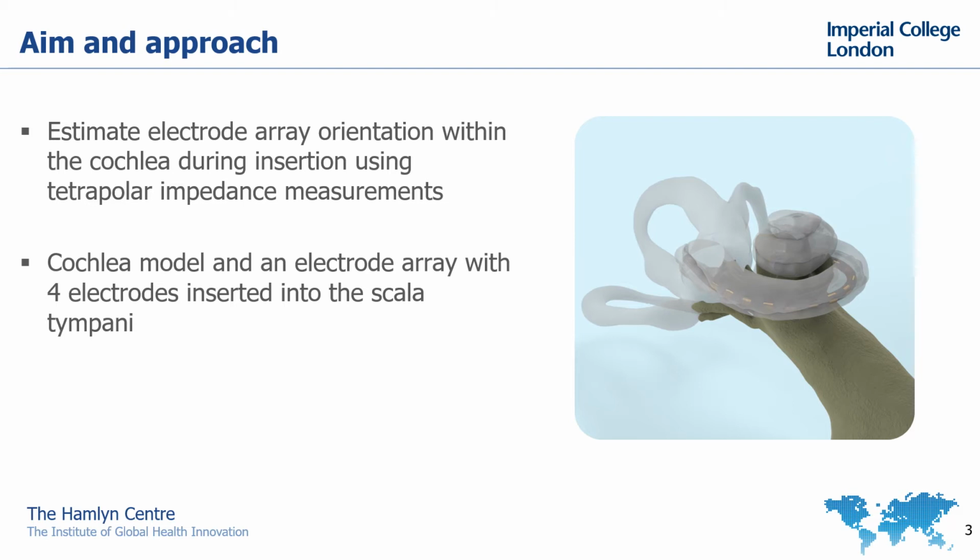To test the feasibility of our hypothesis, our approach consists of a finite element method model with a cochlea and an electrode array that has 4 electrodes inserted in this cochlea.